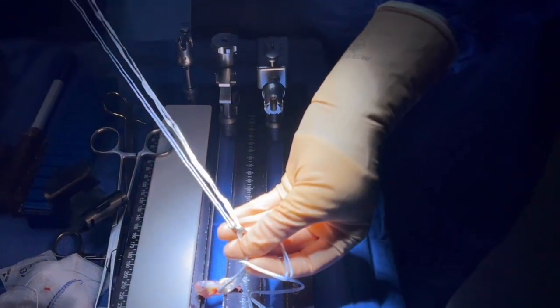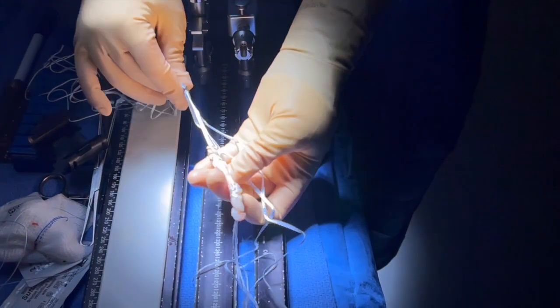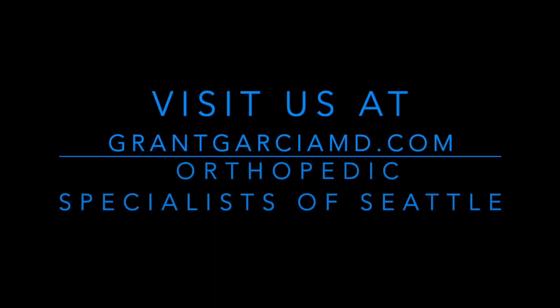There are tapes to prevent fingers from getting cuts on them. And the internal brace is built in. We've been really happy with this new device. Thank you.